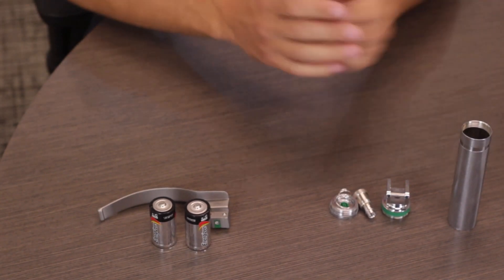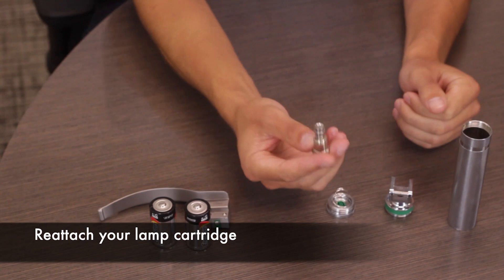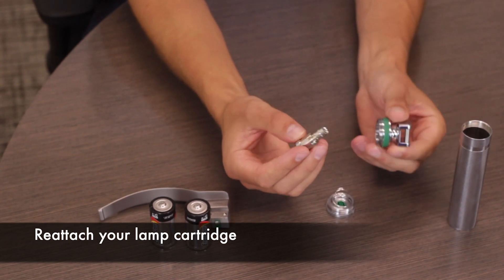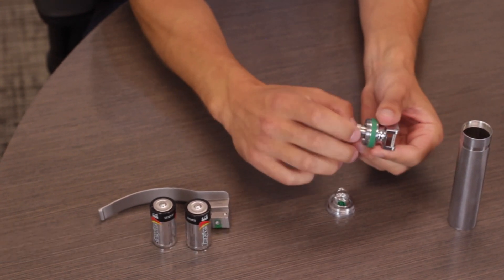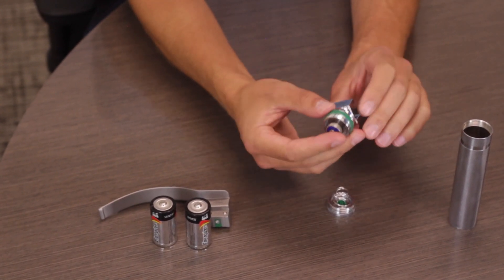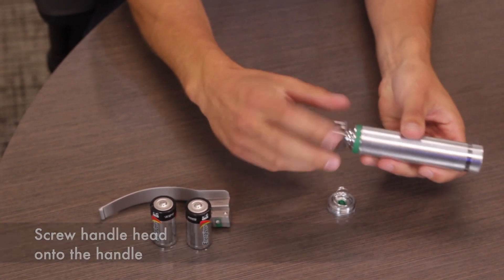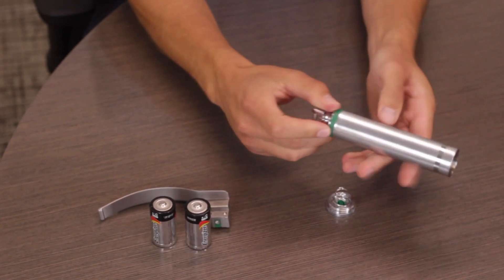Once you've completed the sterilization and cleaning process, the device is ready to be reassembled. The first step is to take your lamp cartridge, reinsert it into the handle head, and tighten until it is snug — note that no special tool is needed. Next, retighten the handle head onto the laryngoscope handle until it is snug.